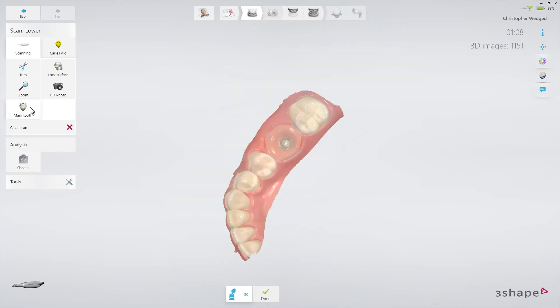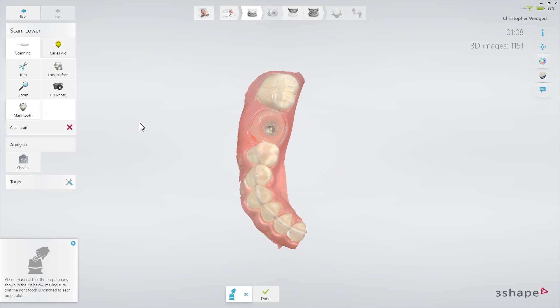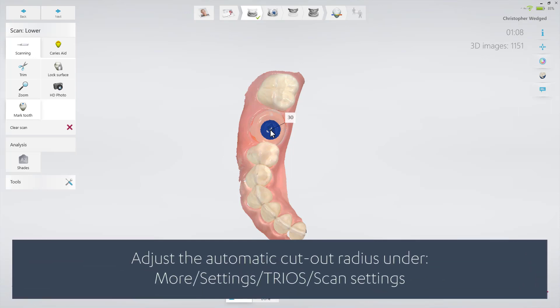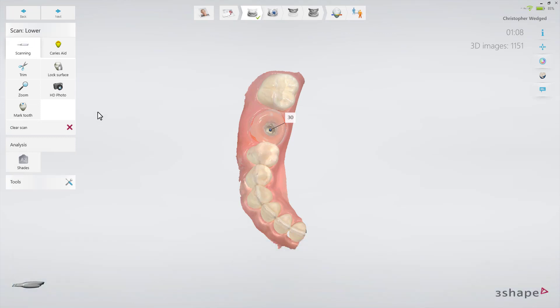You'll see a blue overlay around the preparation mark, indicating the area that will be automatically cut out when going to the Scan Body page. If necessary, you may reposition the preparation mark to obtain your desired cutout. You may adjust the automatic cutout radius under More > Settings > Trios > Scan Settings, or you may turn it off completely if you prefer to trim manually.